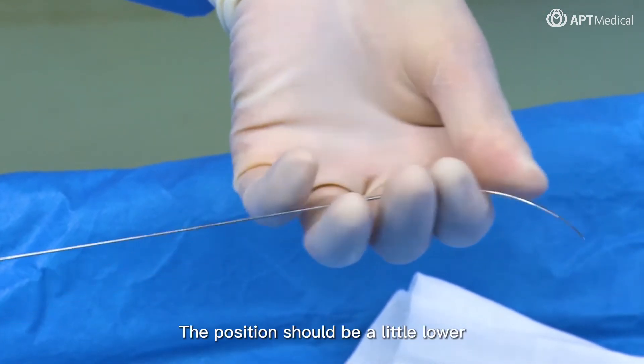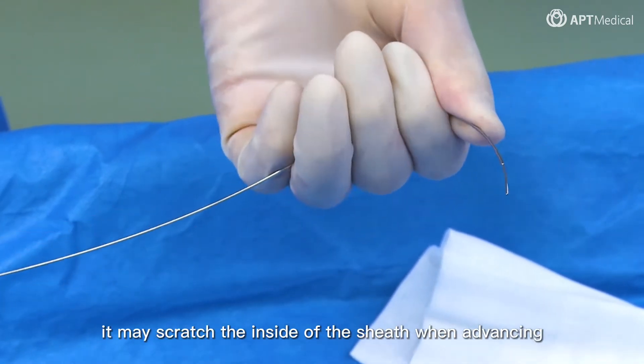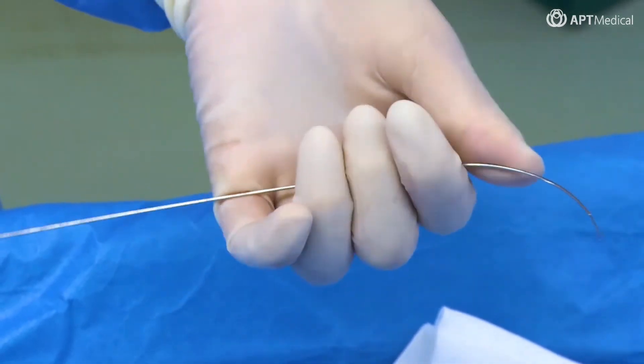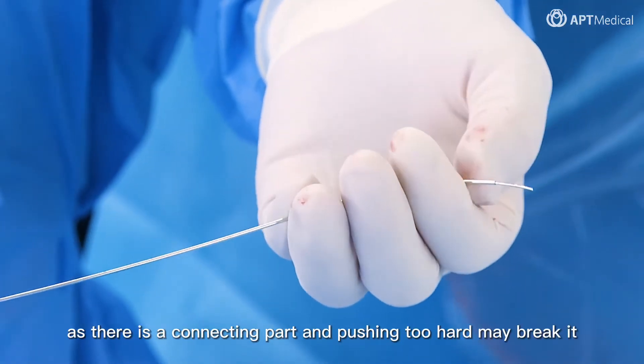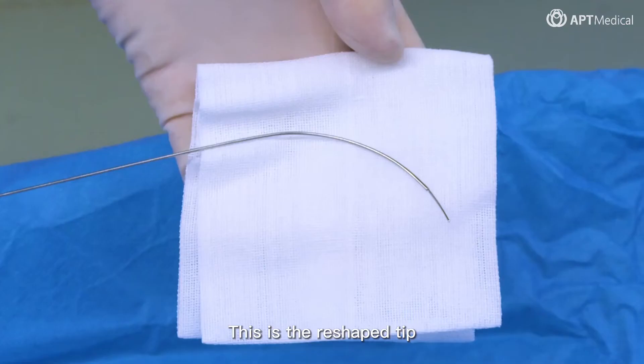The position should be a little lower, because if the angle of the tip is too sharp, it may scratch the inside of the sheath when advancing. Be careful not to shape the tip at the connecting part, as pushing too hard may break it. This is the reshaped tip.